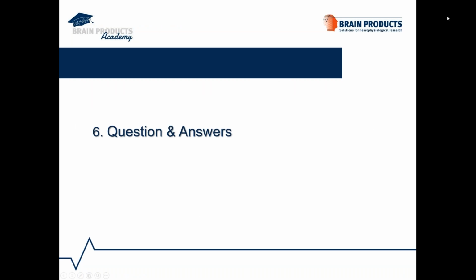Let me check the questions. Okay, so the first question is: does it work with the pre-compiled standalone EEGLAB version? Thank you for the question.